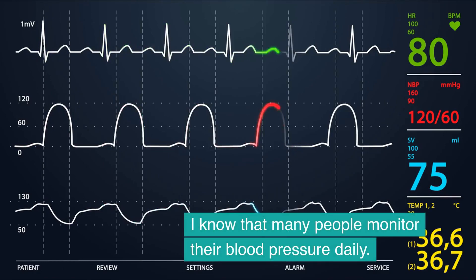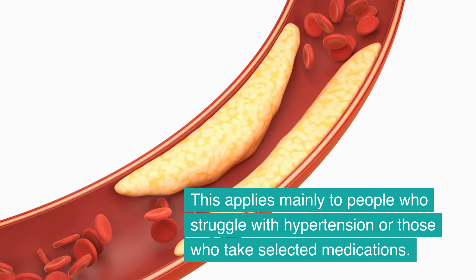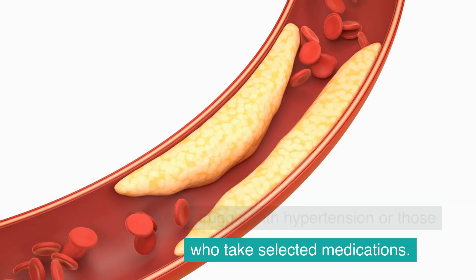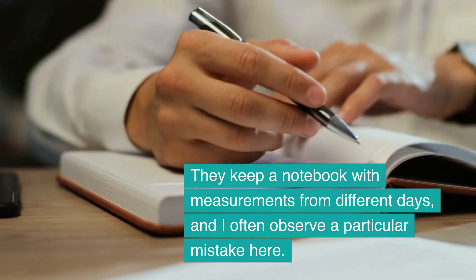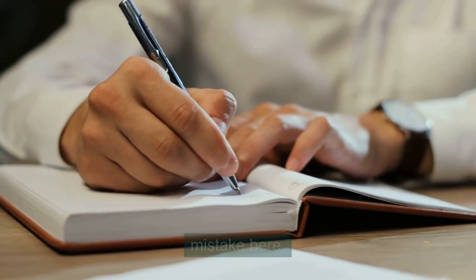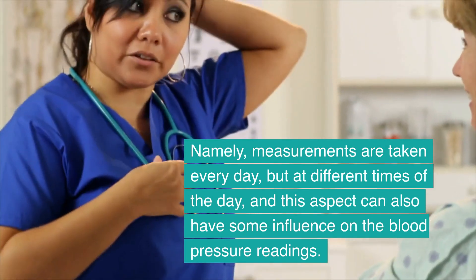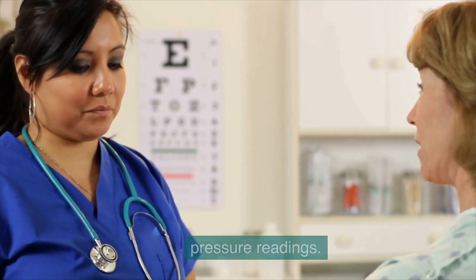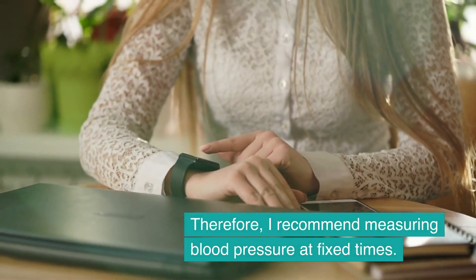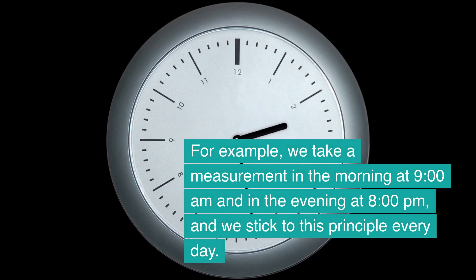Many people monitor their blood pressure daily, especially those who struggle with hypertension or take selected medications. They keep a notebook with measurements from different days, and a particular mistake I often observe is that measurements are taken every day but at different times of the day, which can influence the readings. I recommend measuring blood pressure at fixed times — for example, in the morning at 9am and in the evening at 8pm — and sticking to this principle every day.